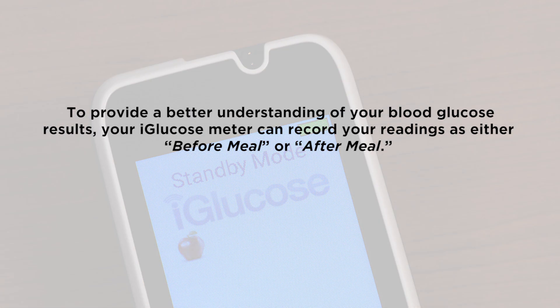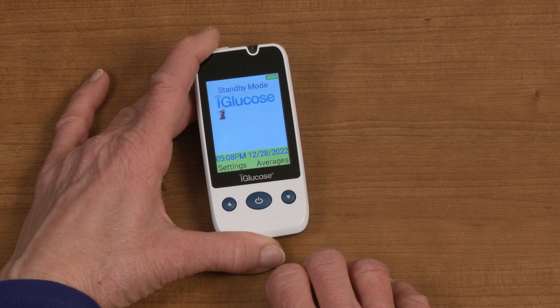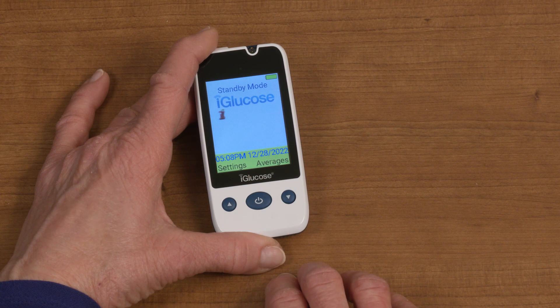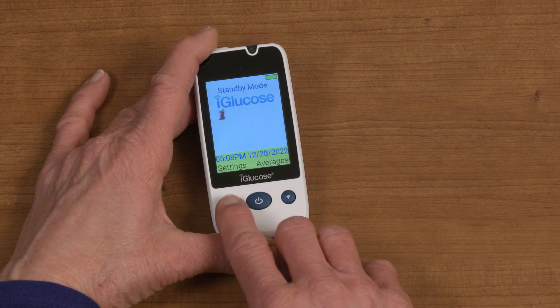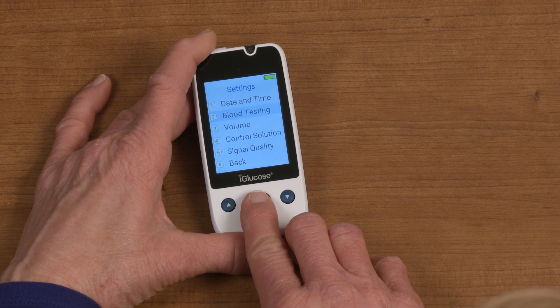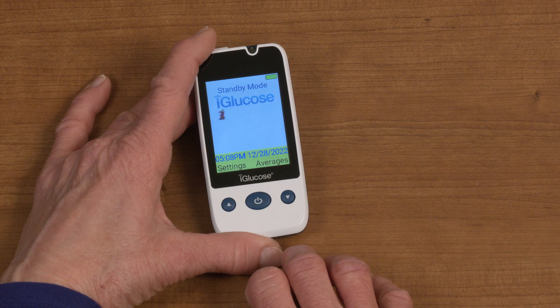To provide a better understanding of your blood glucose results, your iGlucose meter can record your readings as either before meal or after meal. Before meal is represented as a whole apple picture, while after meal is represented by an eaten apple picture. You can set your blood testing mode by pressing the home button when the iGlucose is in standby mode, which will allow you to switch between before meal and after meal modes. Additionally, you can change your blood testing mode by navigating to the settings menu and scrolling to the blood testing option. When you navigate back to the home screen, the correct apple picture will appear.